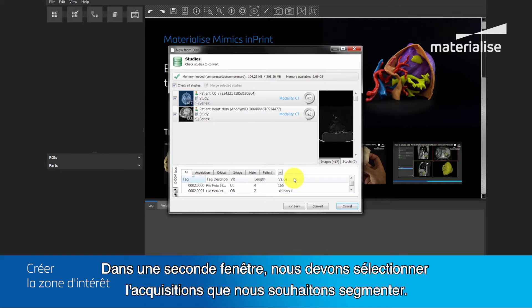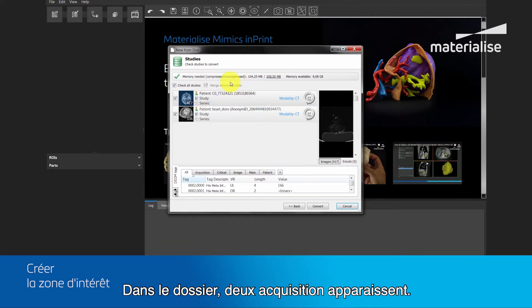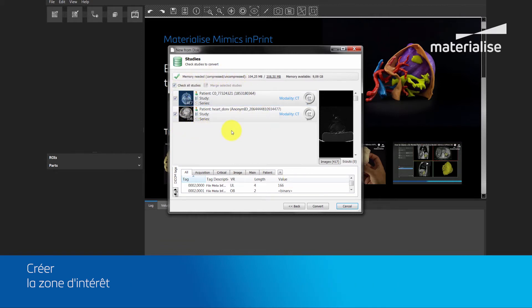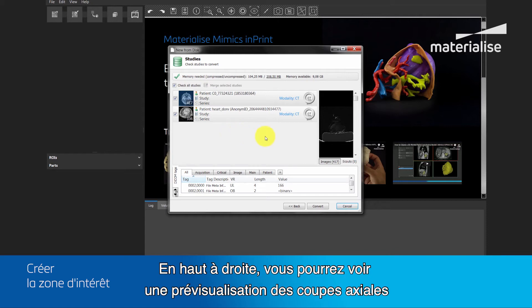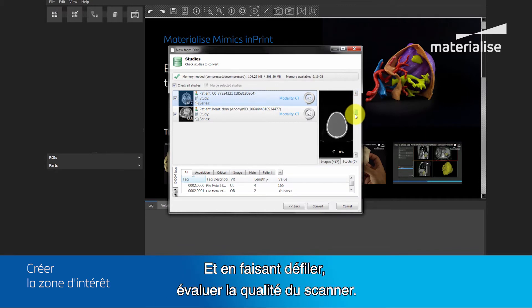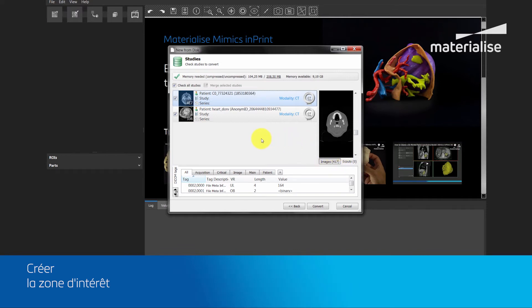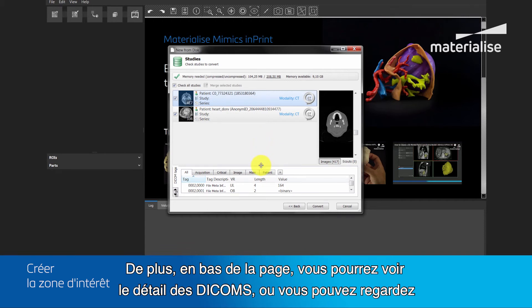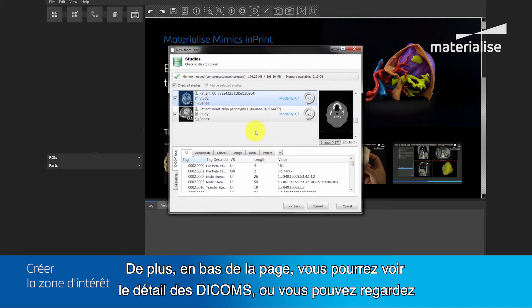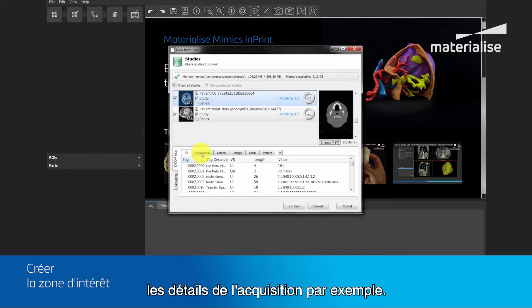In the second window, we need to select which study we want to segment. In the folder, two studies are present. On the top right, you can see a preview of the actual slices, where you can scroll through and assess the quality of the scan. The number indicated here shows the amount of slices in the study. Additionally, in the bottom, you'll see the DICOM tags, where you can look at the acquisition details, for example.